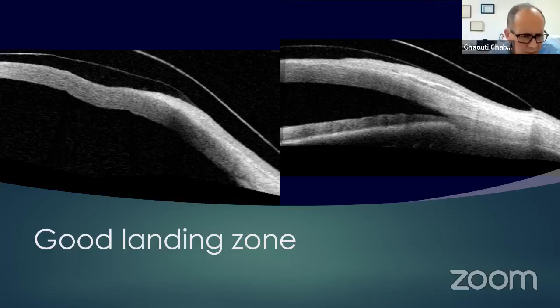On my regular scleral lens designs, forget about the eye print, I always fit lenses with reverse geometry. And usually, as far as the secondary curve is concerned, it's 4 diopters steeper than the base curve. So my regular standard scleral lens designs are all reverse geometry. That helps me give a lift over the limbus. It just makes for a better fitting lens. I don't get edge lift off that way.